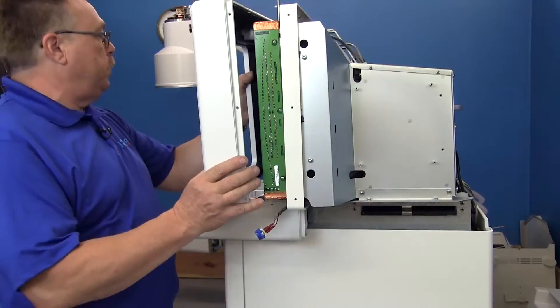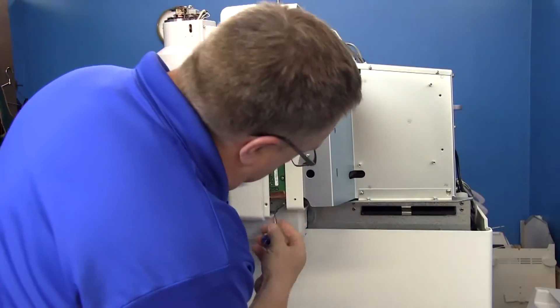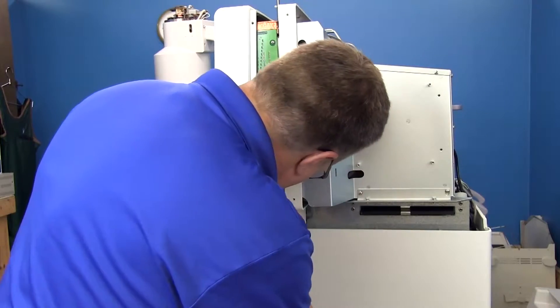Now you start by putting your finisher back on. You kind of have to reach in here and plug the back of your switch on.